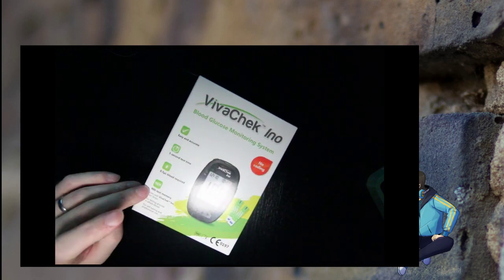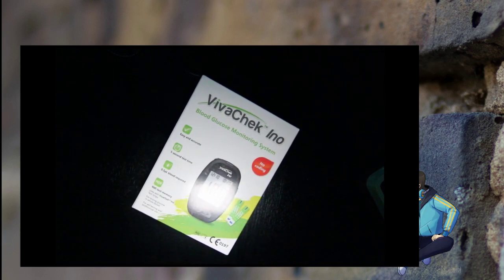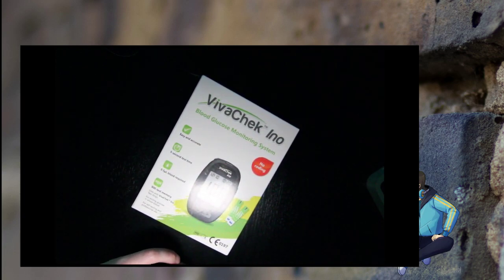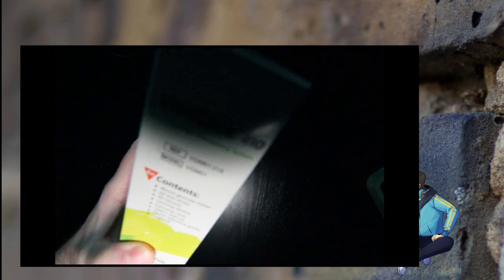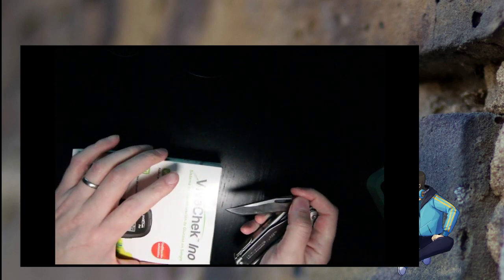But anyway, no coding, test memory, for testing glucose in whole blood, for self-testing and professional use. Comes with strips and 0.5 microliters of blood required. But no coding is because once upon a time the strips themselves would have had a different range of calibration, and so the coding gave you the calibration data. As far as I know, this thing doesn't actually say anything on the box, but online it says it allows you to download the data with a computer and it should have a micro USB connection. So let me go ahead and open it with you.